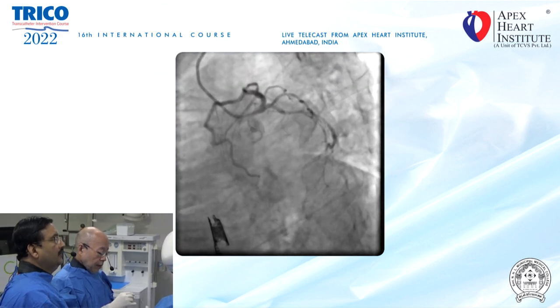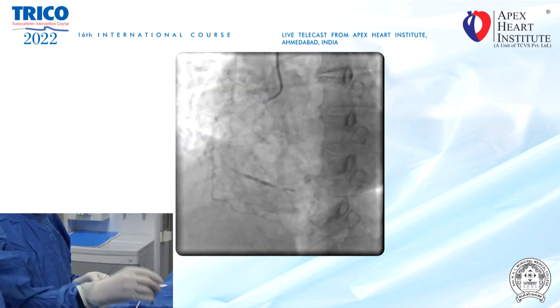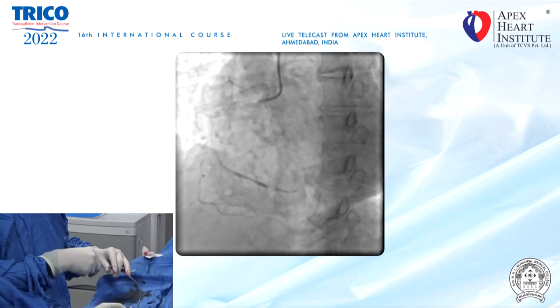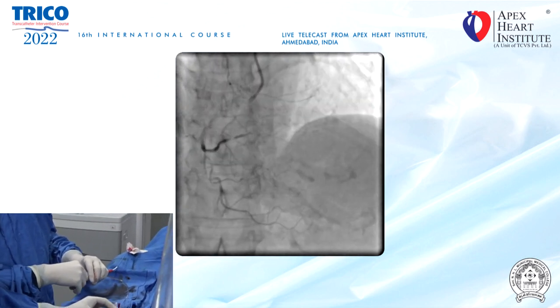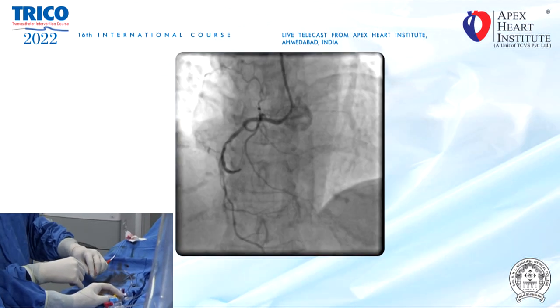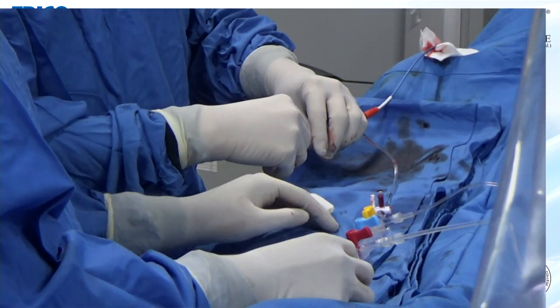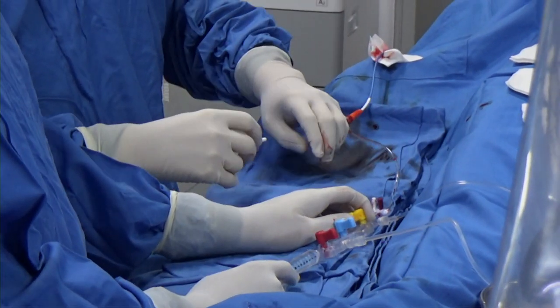For this particular case, there are two tight regions. One is in the LAD, and the second one is in the circumflex. The circumflex looks not so big, but the LAD looks very large for this patient. So, of course, the main target is the LAD. And also, there is some ostial LAD narrowing extending to the left main. So we have to consider treatment for the left main as well. So, there was a suggestion of doing upfront imaging like an IVUS to assess the lesions. Any plans of doing that?